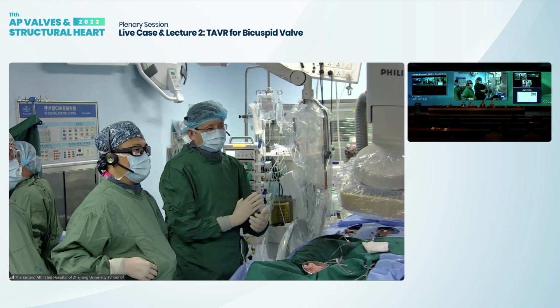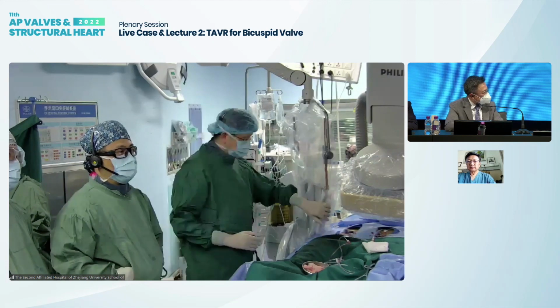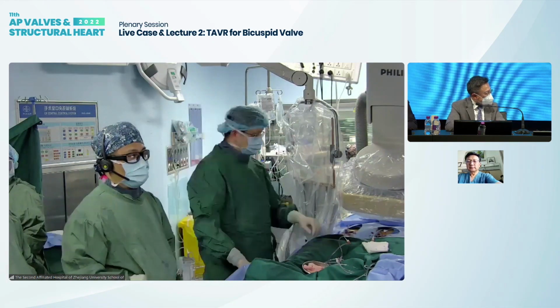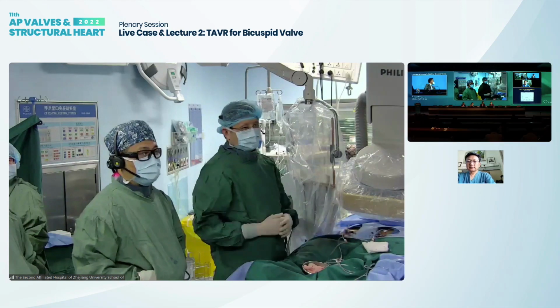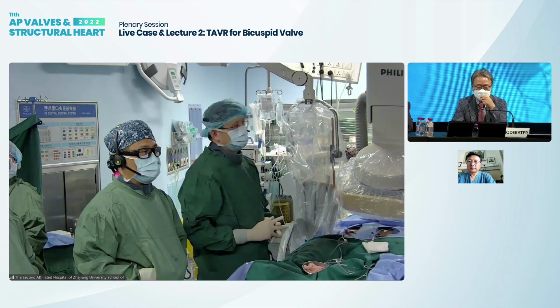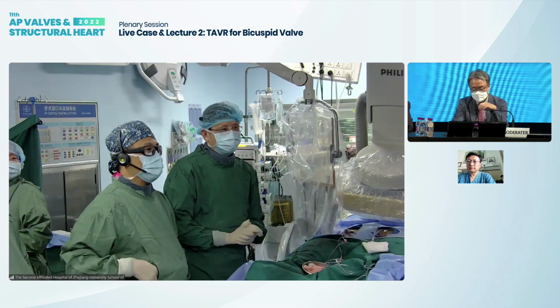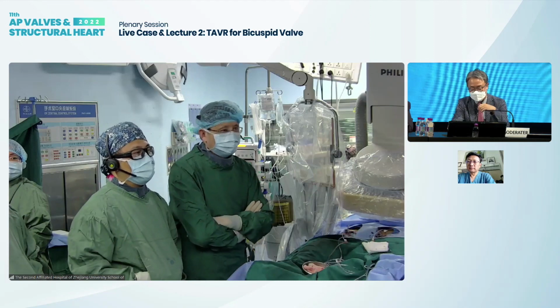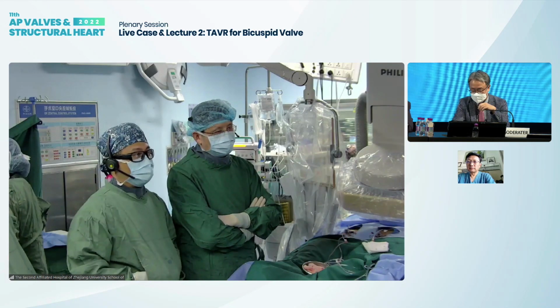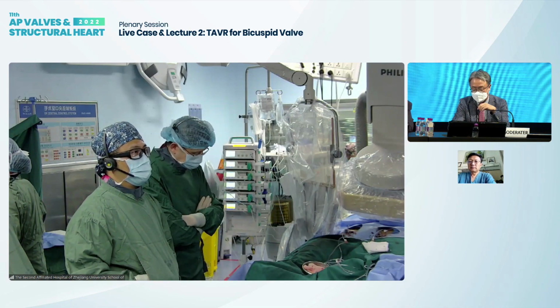Thank you. Maybe we could ask the panelists, if they don't have the Venus A-Plus, what would you use in your own country? Maybe a quick discussion. Professor Wang, this is, I think, a very nice and challenging case. I'm DW Park. Could you briefly comment on what is the main difference of the Venus A-Plus versus the conventionally used Evolut R system?